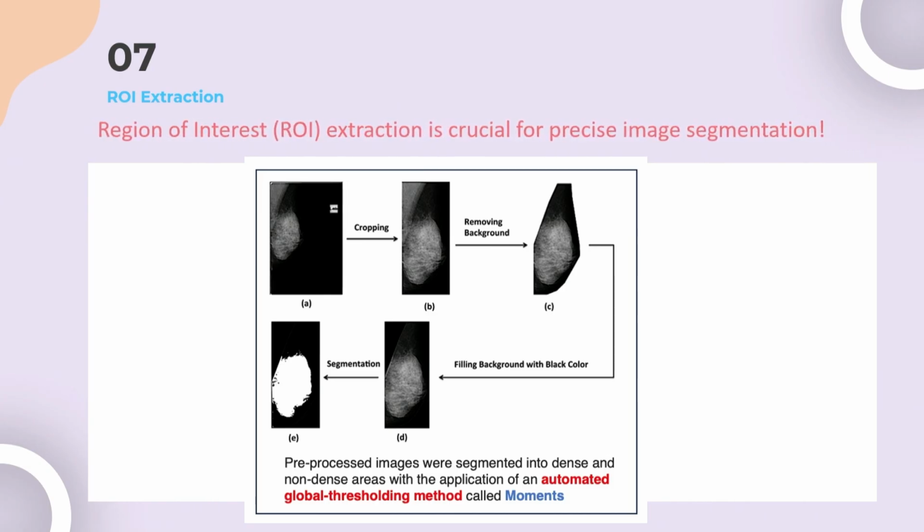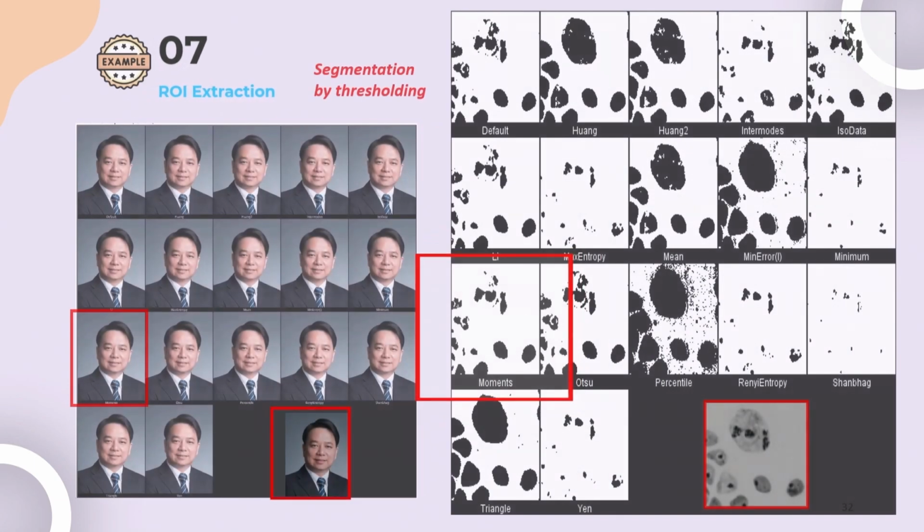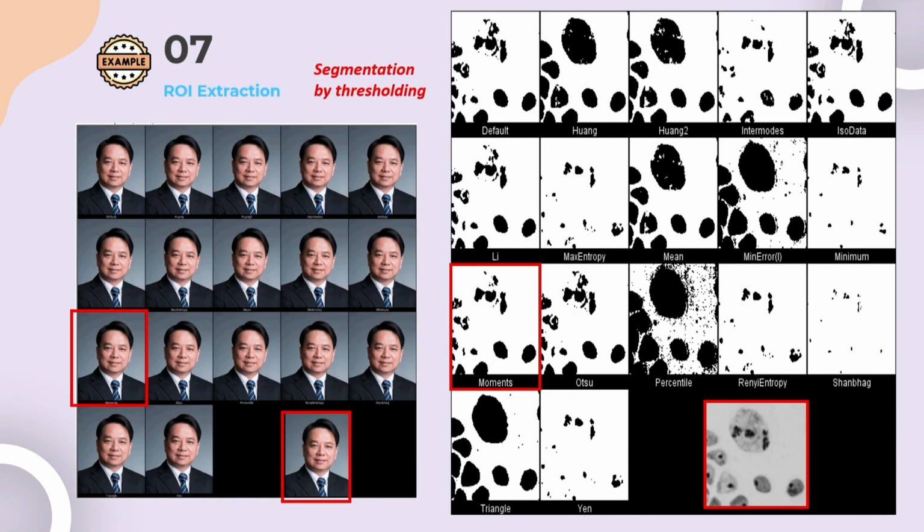So let's say from 0 to 100, you want to make a clear cut and convert everything on the image below or above a certain threshold. Then you will make an image like this. On the far left corner, we set the thresholds, and everything will be only black and white.